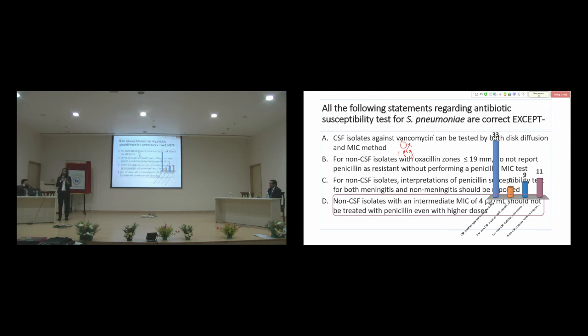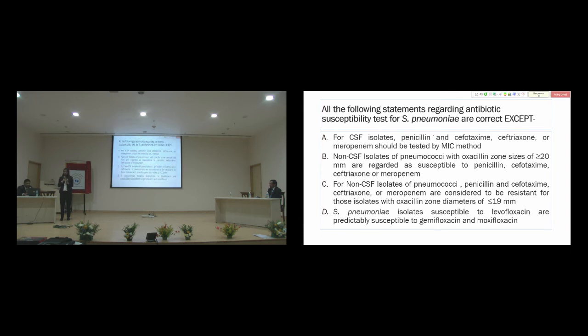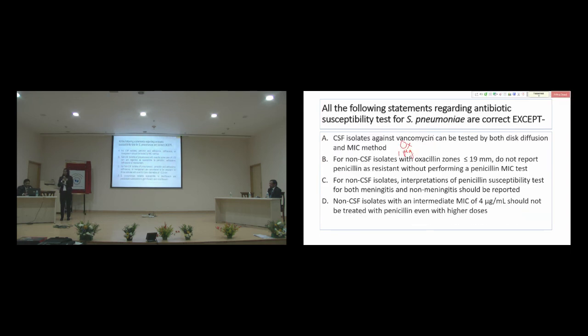And for vancomycin, you can do disc diffusion. For a non-meningitis isolate, what is the protocol? You test with 1 microgram oxacillin. If it is more than or equal to 20 mm, you can report it as sensitive. If it is less than or equal to 19 mm, you cannot report it as resistant. You have to perform an MIC test.